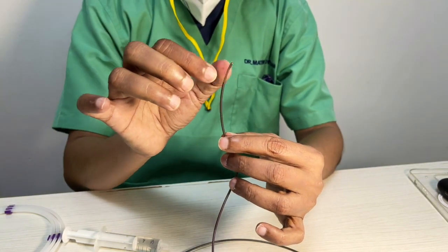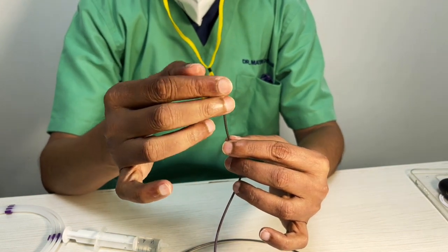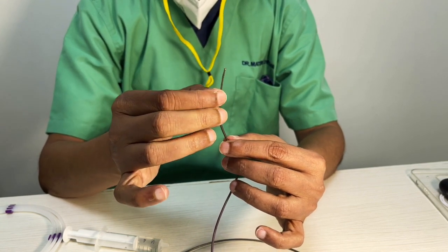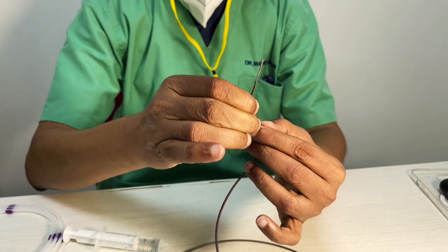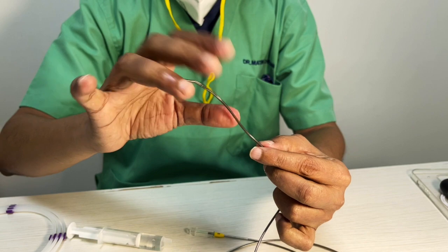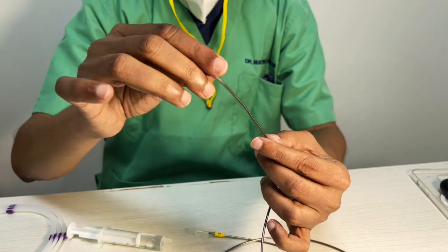This is an aspiration catheter, one of the best aspiration catheters, but it kinks. Now, this kink may not matter too much when it is distal. Remember, inside this, there is a sleeve. The sleeve is what protects it to do a Solumbra-like technique, otherwise you can't do it. Now, see this, it flattens all over. And because of this, again, in a very tortuous anatomy, if you put a tight loop, you'll find it goes off. See, this is the problem. It gets permanently kinked, cannot straighten. Whereas in the others, it can straighten.